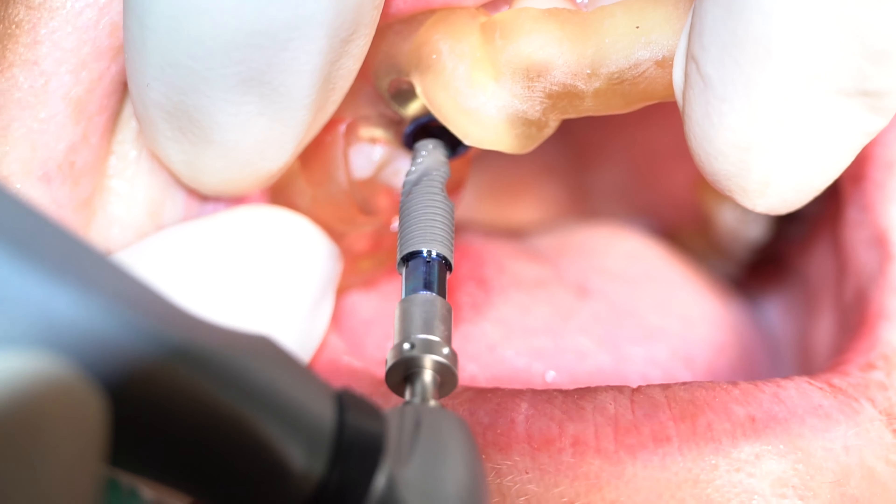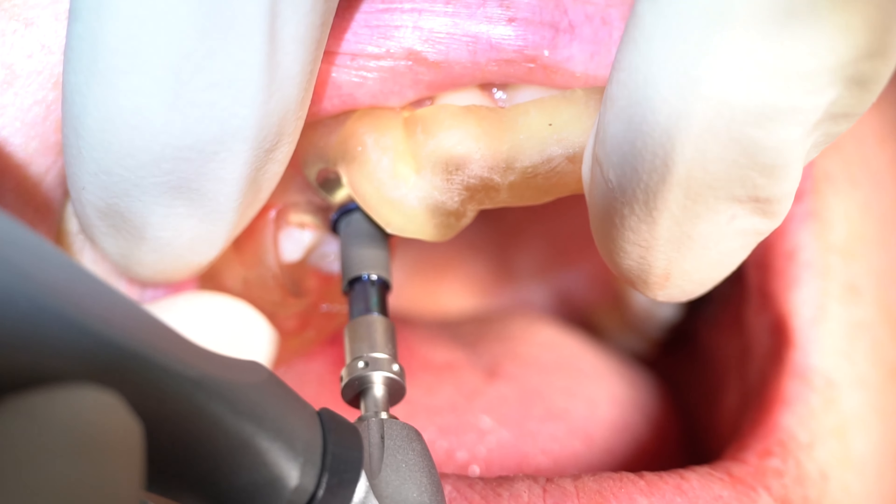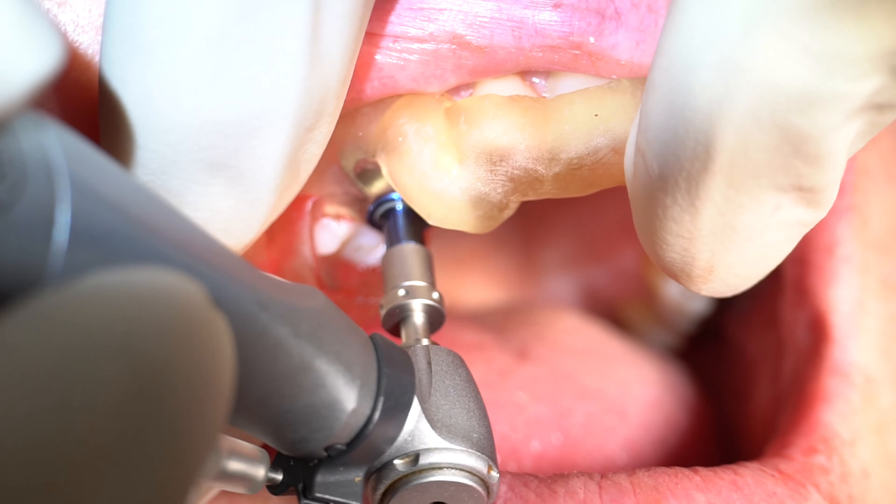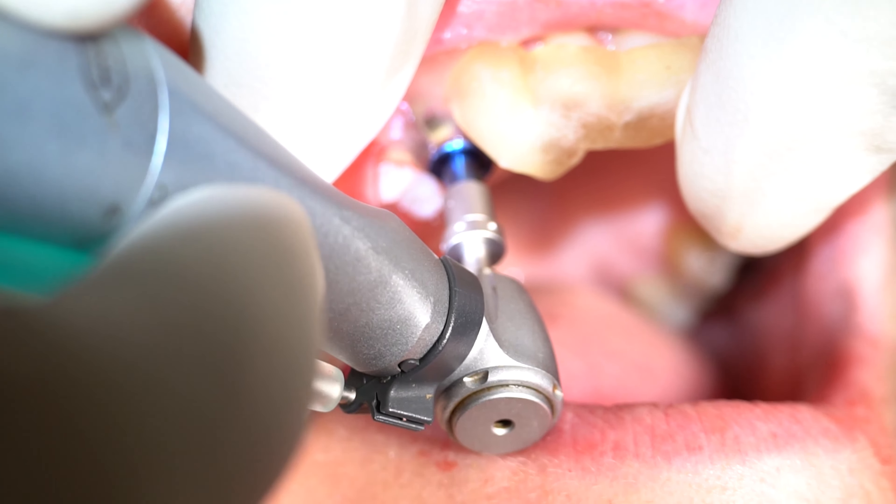If you want to really simplify what an implant is, or what the vast majority of implants are like, it's like a screw. Some people even call them screw-in teeth. The cool thing about a screw is if you just unscrew it, it comes out. And dental implants in a lot of cases can just be unscrewed.